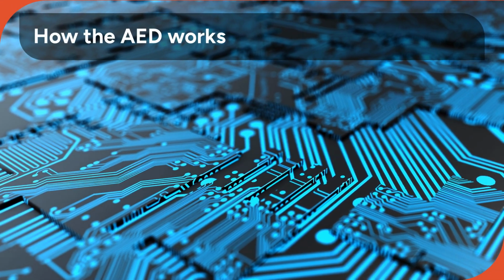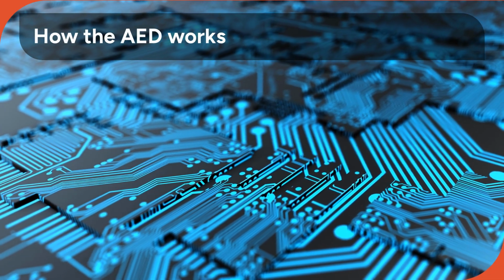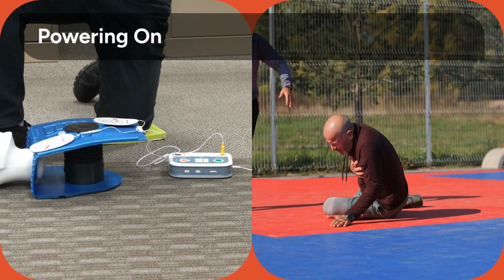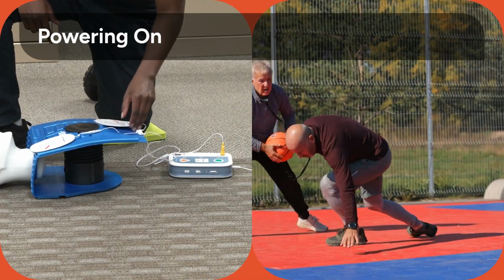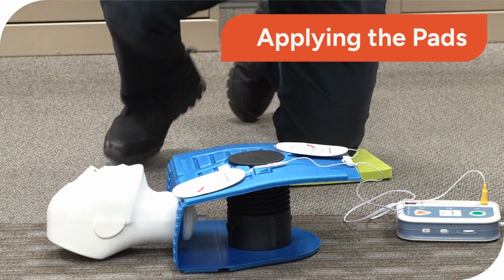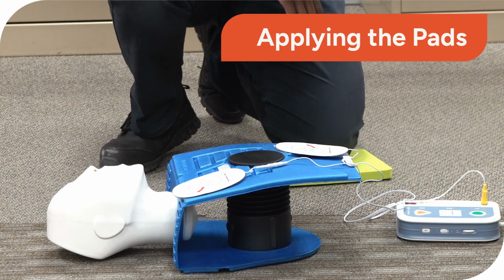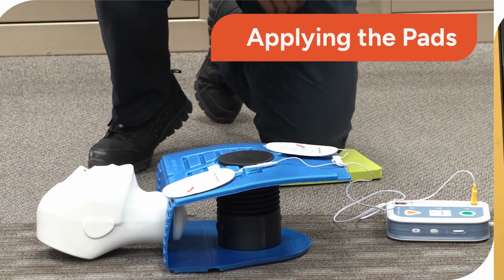The AED is essentially a miniature computer designed to guide a rescuer through the process of defibrillation. It uses sophisticated technology to analyze the heart rhythm. The first step is always to turn on the AED. Once activated, the device provides clear, step-by-step voice prompts and visual instructions to guide the user. Next, the electrode pads are attached to the patient's bare chest in specific locations, usually following diagrams found right on the pads themselves. These pads serve as sensors and deliver the electrical current.